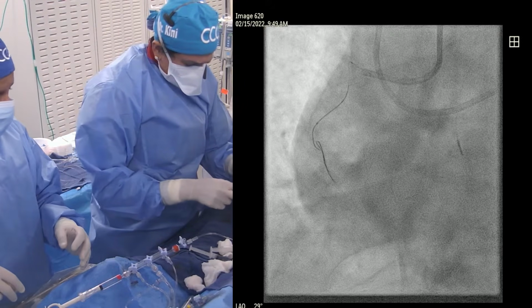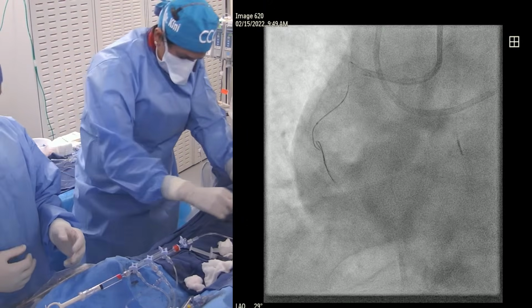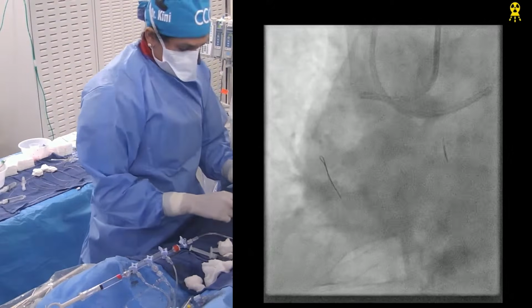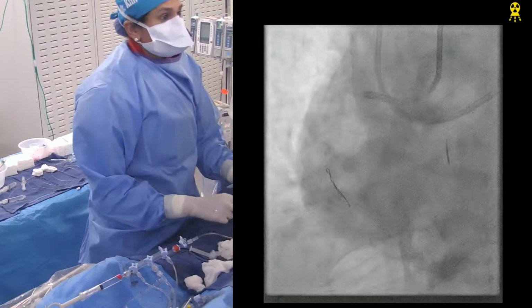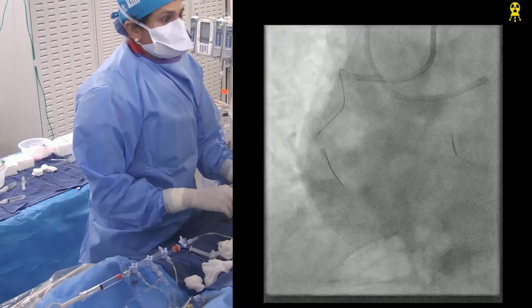I think I still want to try a Starter once. 20, please. Yeah, put it in the water. Now, that patient will need a connection.